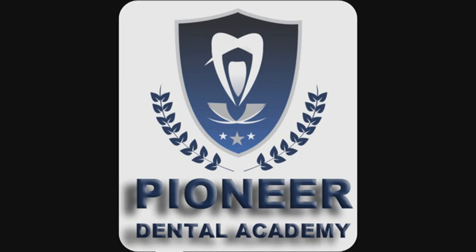Now see the layers. You have a phosphor layer, reflecting layer, protective layer, and a plastic base. And the same thing will be on the other side. Okay. You have two sides for that. It's been sandwiched. So you're going to clean the intensifying screen. If it's not clean, you will have those marks on your final image.